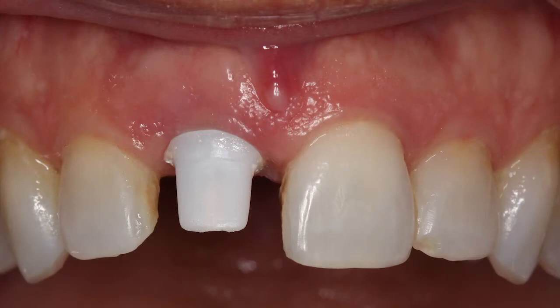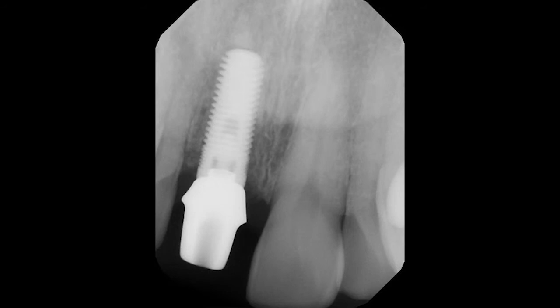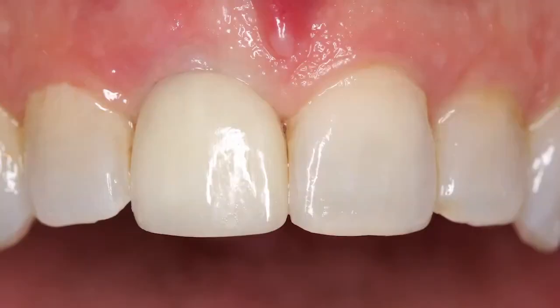In Figure 23, I want you to note the natural emergence profile and ideal gingival margins of the final monolithic zirconia abutment, helping to eliminate any periodontal concerns of residual subgingival cement. The digital radiograph in Figure 24 illustrates ideal margins of the custom abutment and complete seating into the body of the implant. The final Bruxer crown was cemented into place, as shown in Figure 25.